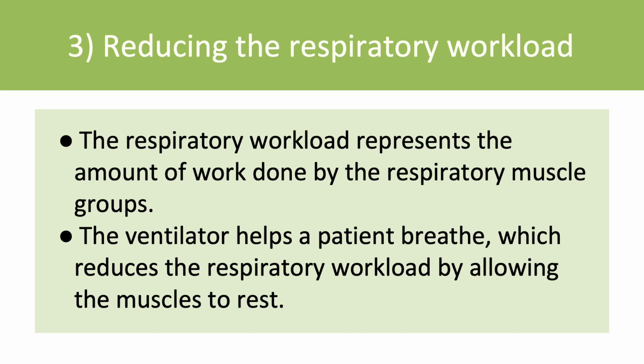Lastly, the ventilator reduces the respiratory workload. The respiratory muscles of patients with tachypnea or labored breathing are very exhausted doing their best to improve oxygenation or maintain ventilation. This is where the ventilator comes in to help and rest the respiratory muscles. However, as will be discussed later, caution must be taken not to use the ventilator only for recovery from respiratory exhaustion, as this can lead to sedation, intubation, and other harmful effects.